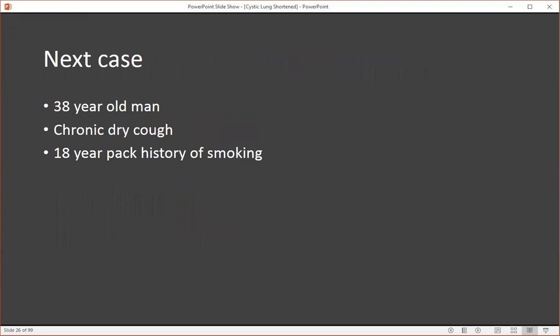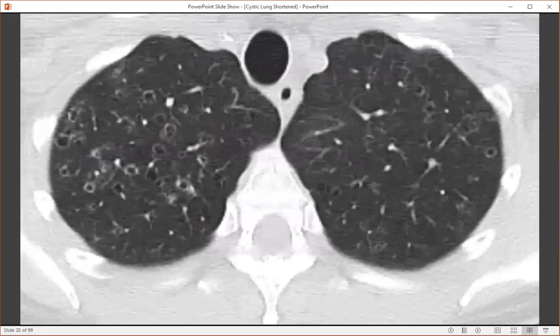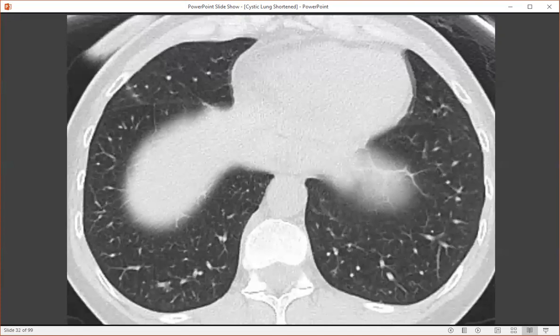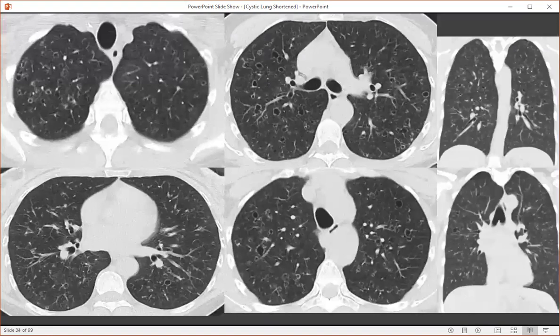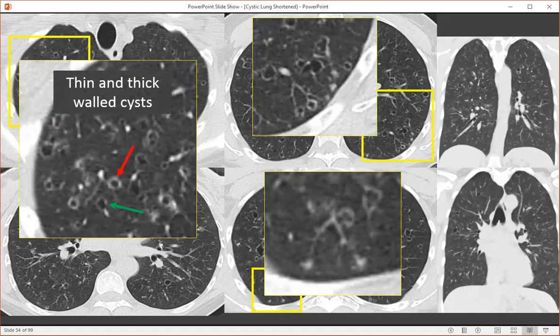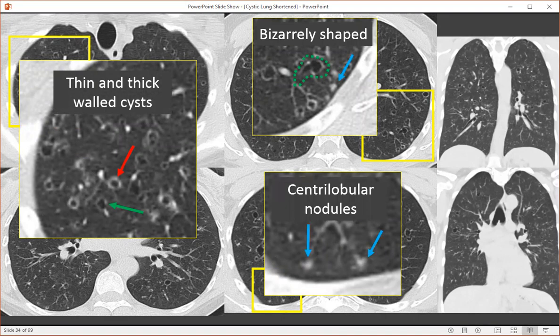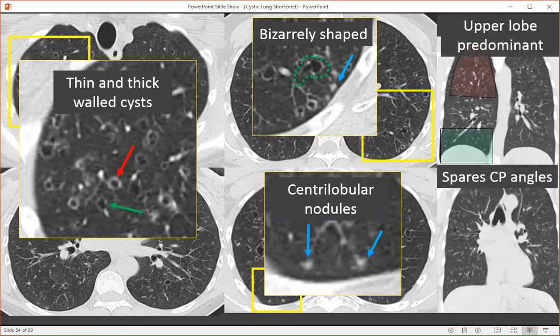The next case is a 38-year-old man with a chronic dry cough and 18-pack-year history of smoking. On CT, we can see several thin and thick-walled cysts in the upper lung zones, as well as small nodules within the lung parenchyma. Notice that this disease is predominantly confined to the upper lung zones, as seen on the coronal CT. We can see both thin and thick-walled cysts — very different than our previous case — and some bizarrely shaped cysts, not regular like we saw in LAM. This disease is mainly confined to the upper lung zones with costophrenic angle sparing and lower lung zones spared.